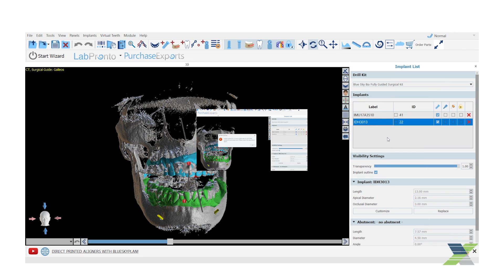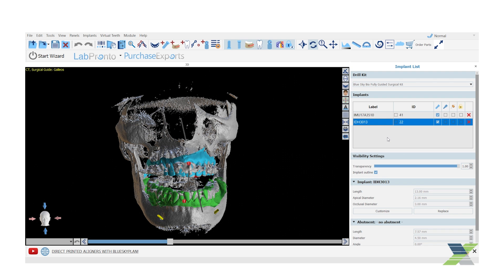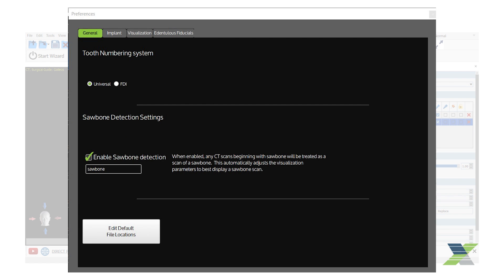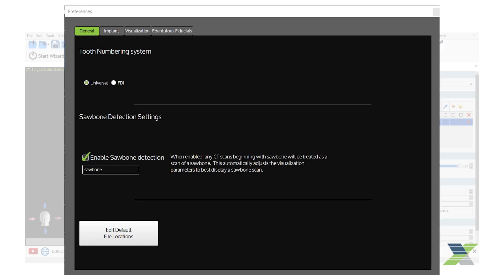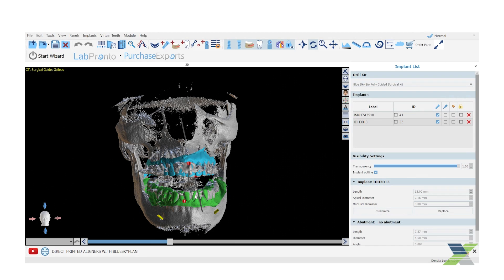Be aware, however, that once imported into the XGUIDE software, the tooth number format will reflect what you have selected in your XGUIDE preferences, either universal or FDI. To export the case from Blue Sky Bio, click File, Export To, and select XGUIDE system from the list.